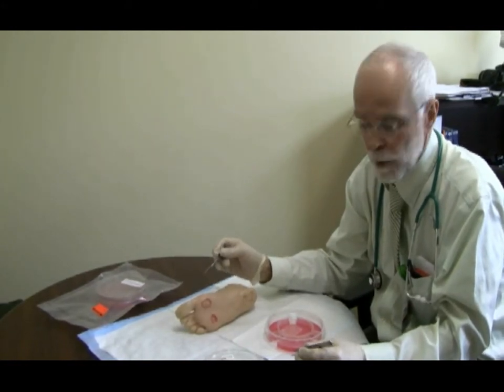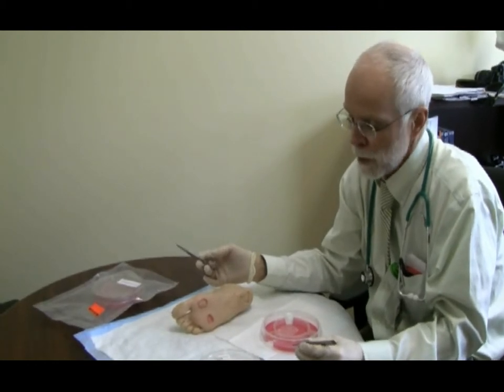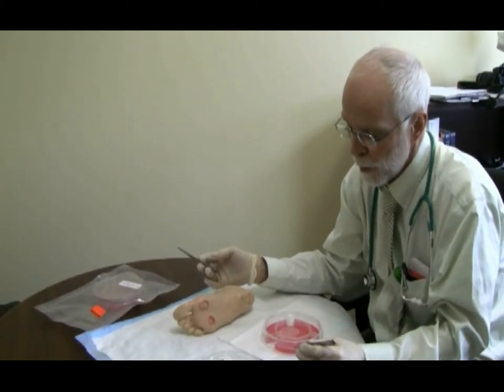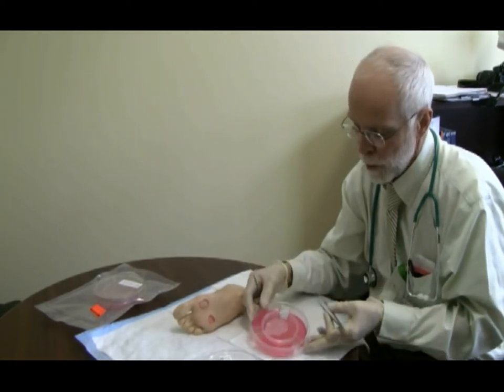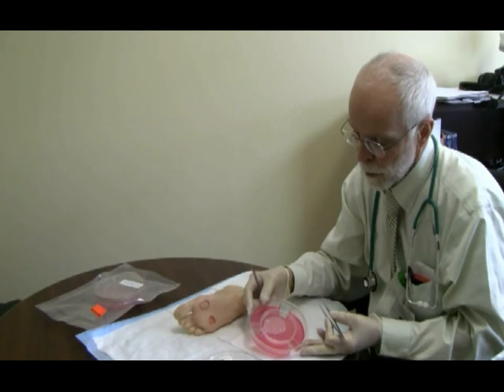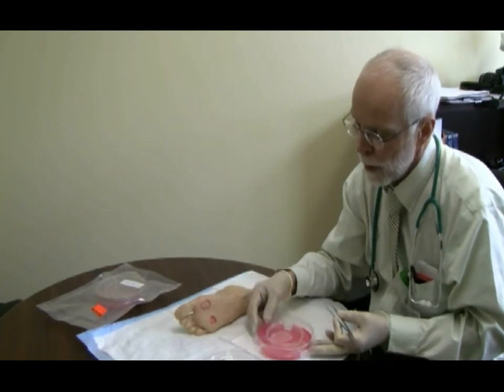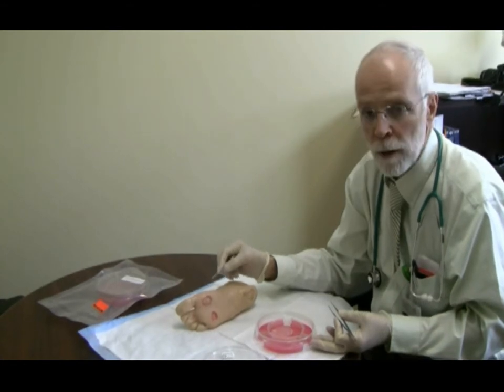We can speed healing along, especially in stalled wounds, by applying some biologic material. There's a variety of them, but a very good one — perhaps the best — is Aplograph. This is cultured skin from human skin. There is living tissue in here, and if we apply this directly to the wound we can speed along and jump start the healing of this wound.